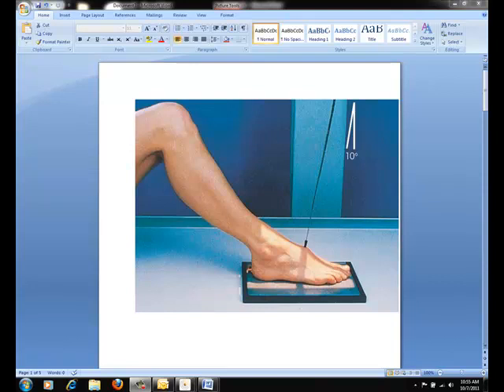The AP projection of the foot is actually an AP axial projection because there's angling of the central ray 10 degrees posteriorly to the IR. When the 10-degree posterior angle is used, the central ray is perpendicular to the metatarsals, which reduces foreshortening. Additionally, the TMT joint spaces of the midfoot are also demonstrated better.